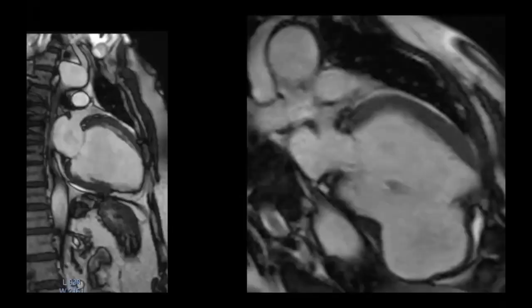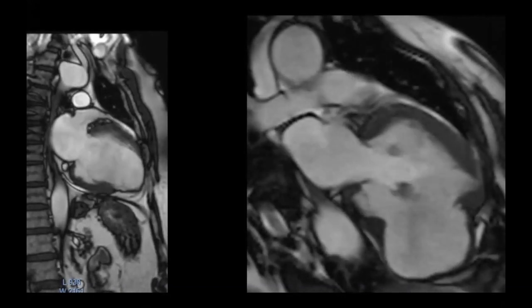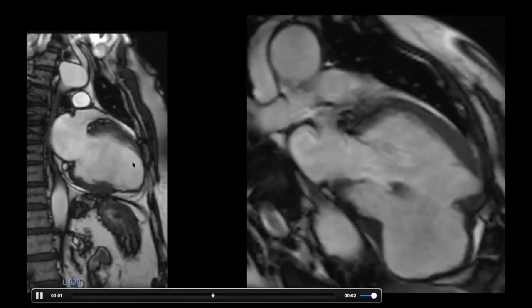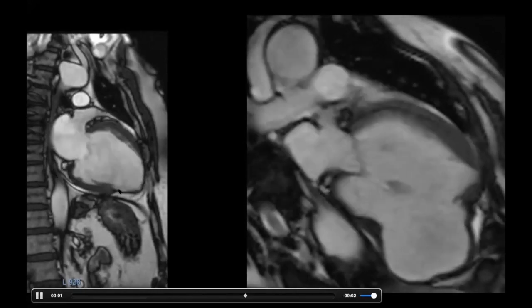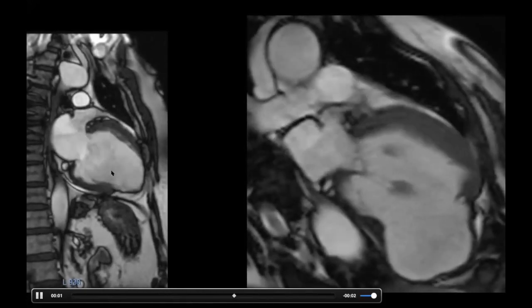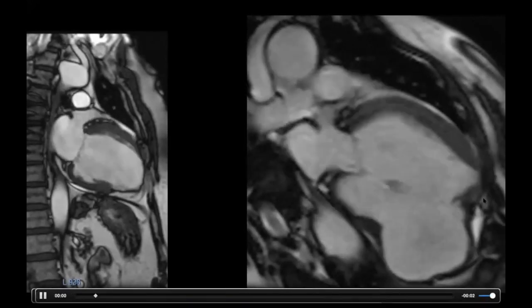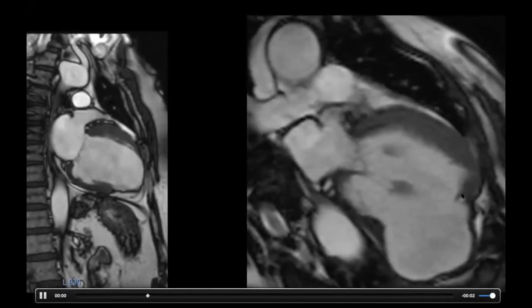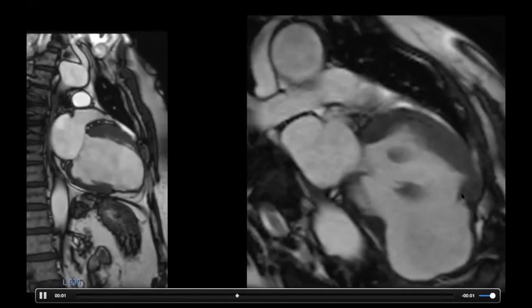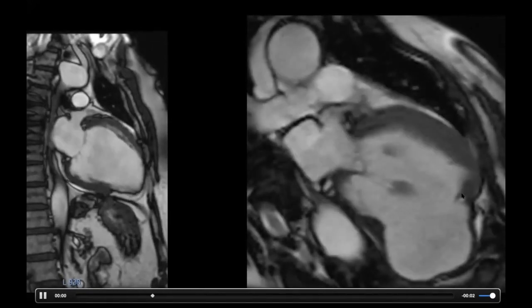When we look at an abnormal heart — for example, a patient with infarction showing hypokinesis of the apex, apical anterior segment, and inferior segment toward the apex — dyskinesis within the ventricle can lead to wrong estimation of ventricular function on echocardiography. Similarly, a case with a large aneurysm in the posterior wall of the LV cannot be accurately assessed for volume and function by echo or even nuclear medicine. This is where cardiac MR is far superior.